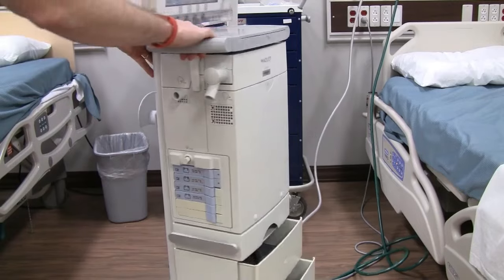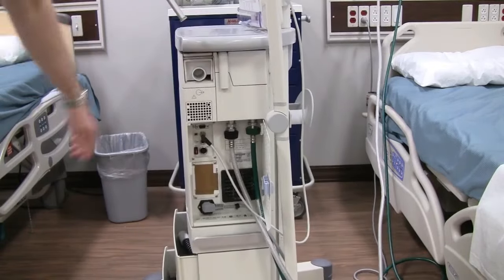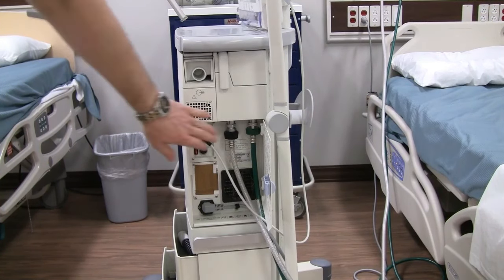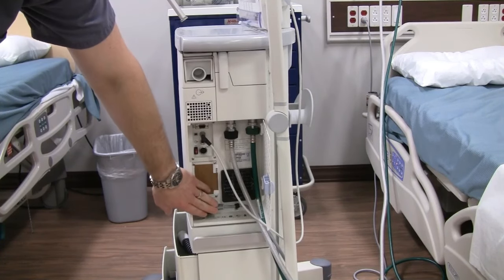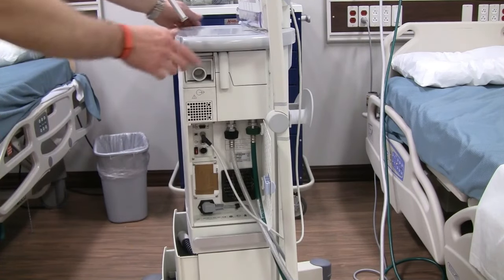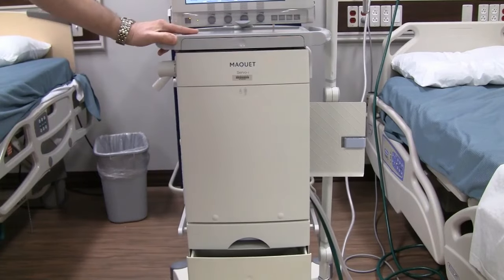Turning to the right side of the ventilator, this is where all of our connections go. We have our air and oxygen connections, a connection from the monitor on top, and our power connections. Always make sure that we are plugging into a red outlet and that we have all of our connections made before we start our pre-use check.